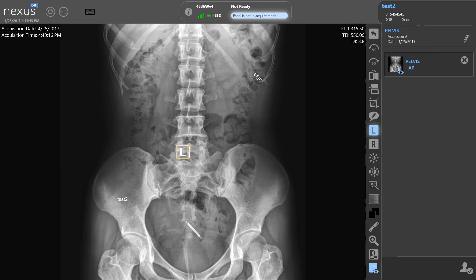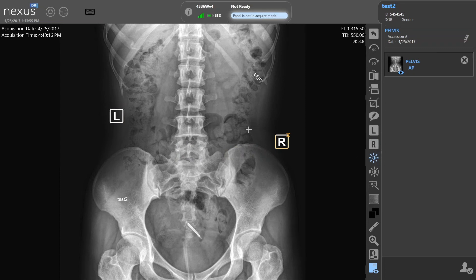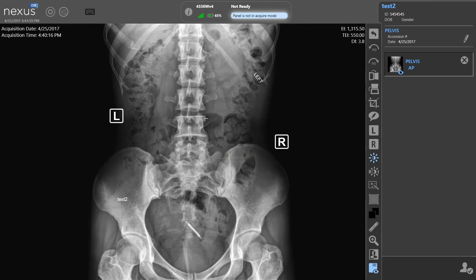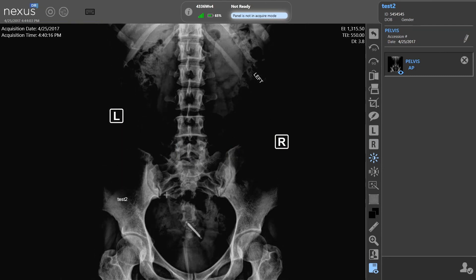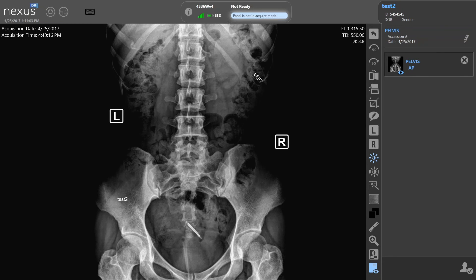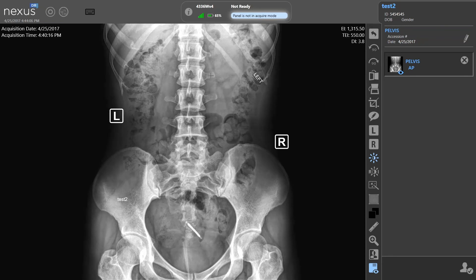We can also put markers on the films. You can either click and one will appear, or you can drag it over and place it where it needs to go. A standard feature for most of these type viewers would be window and leveling. Just click on the window level and then drag the mouse up or down, and it will change the brightness and contrast of the image for you.